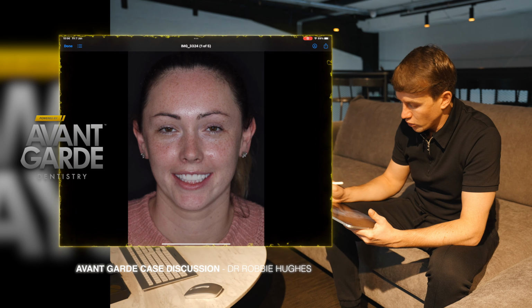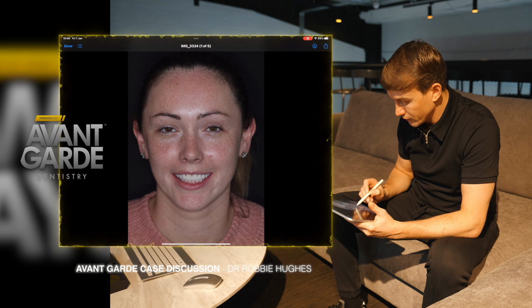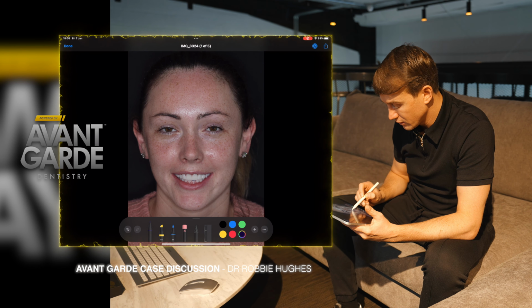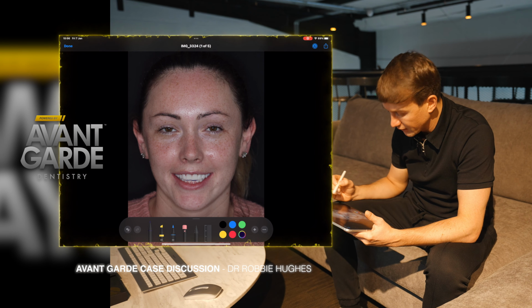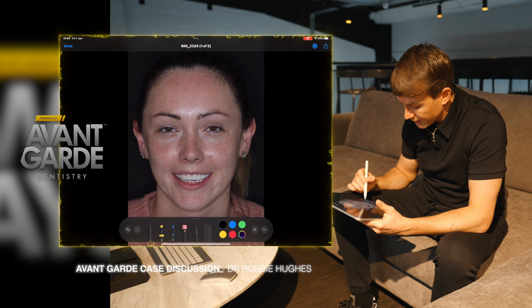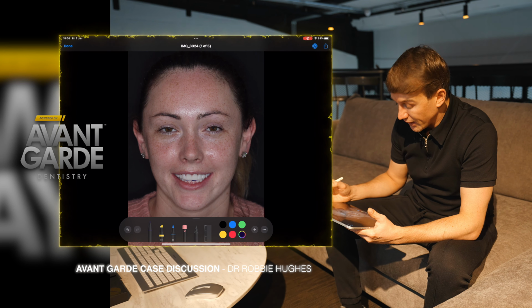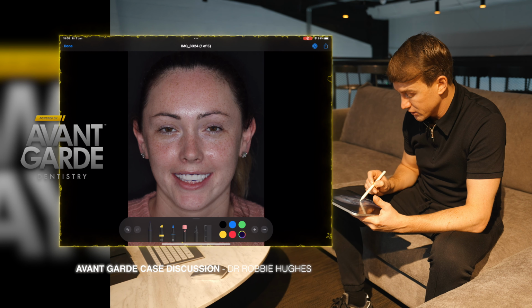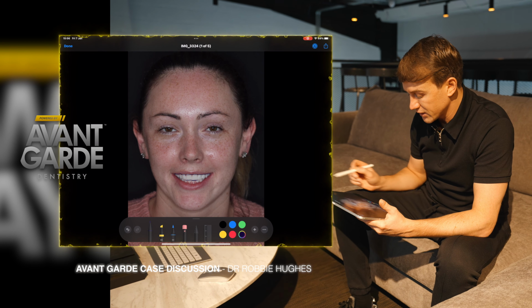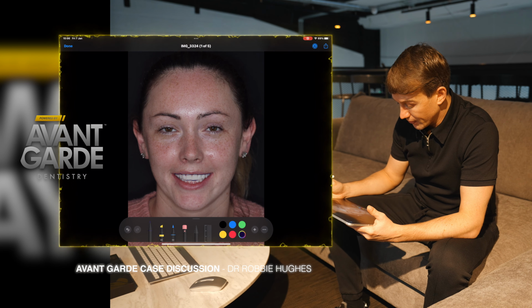So, to the mock-up, full face. Looking at that first, we look at the new incisal edge position. Length is pretty good, everything's been leveled off and squared off. The lateral incisors and the canines start to take a nice form and shape. There's nice volume to the smile, and you can see that all this gumminess and excess show of the gingiva has now been taken away.